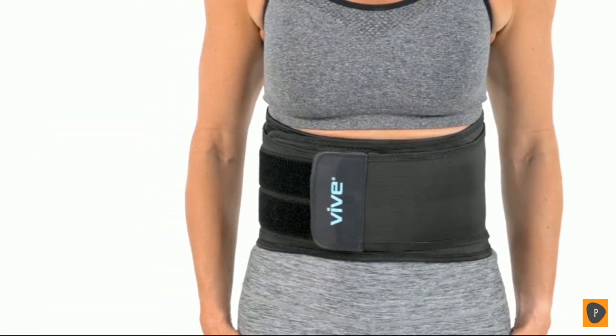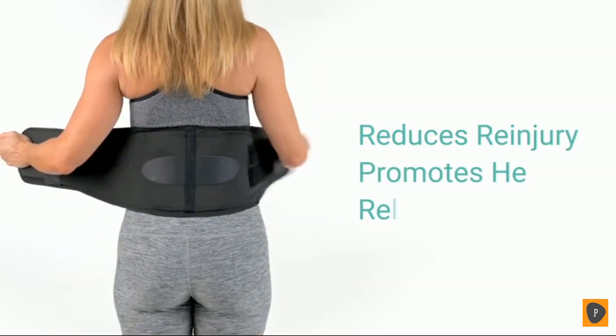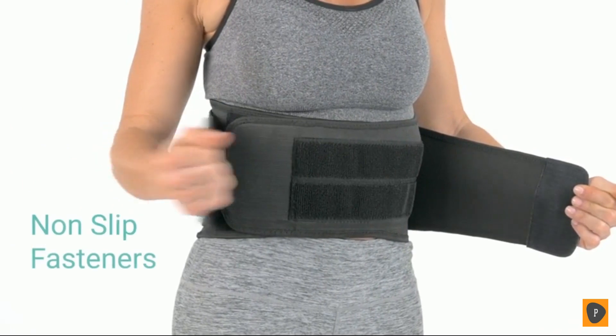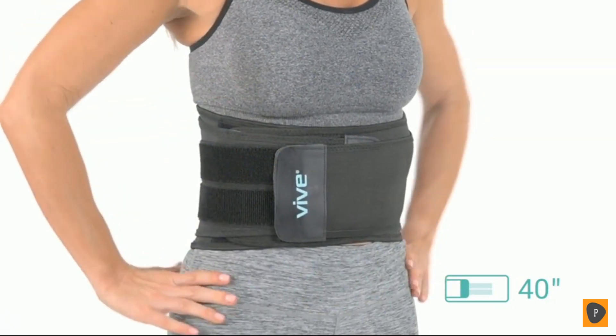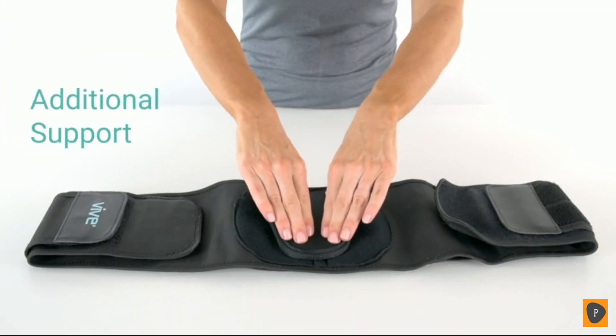The Back Brace by Vive provides targeted, pain-relieving support for the lower back. Gentle compression therapy reduces the risk of injury, promotes healing, and relieves chronic pain. Durable, non-slip fasteners allow you to easily adjust the compression level and customize the fit between 32 inches and 40 inches. A removable lumbar pad supplies additional pressure and support for targeted pain relief.